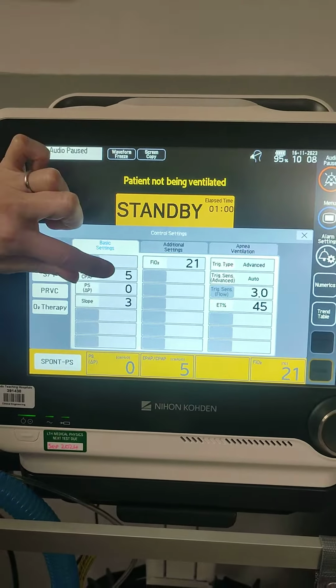okay, along this side you'll see values of the peak inspiratory pressure, minute volume, tidal volume, respiratory rate and the leak. The leak should be around 20 to 50 litres so that you're not putting the mask on too tight. The settings are on the bottom here.